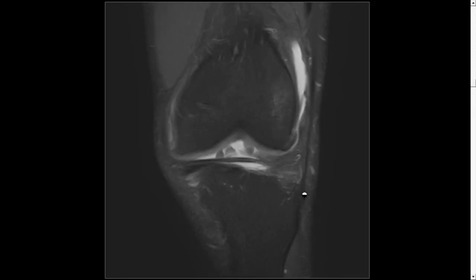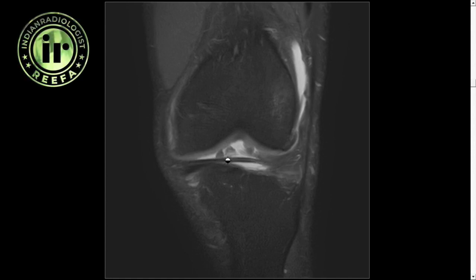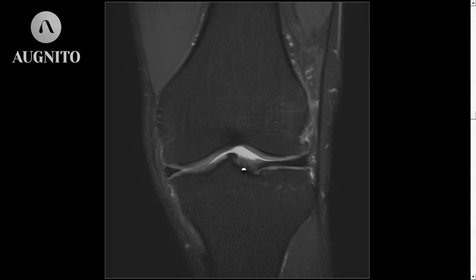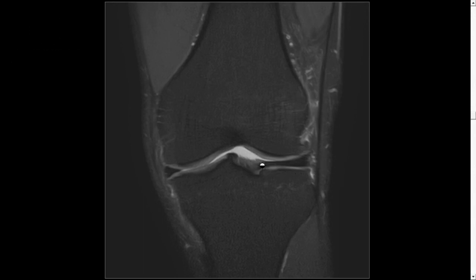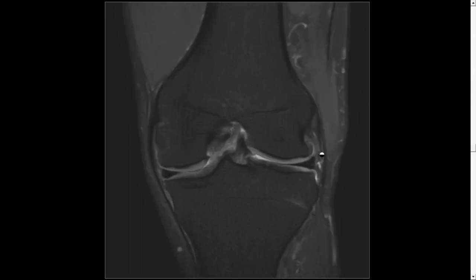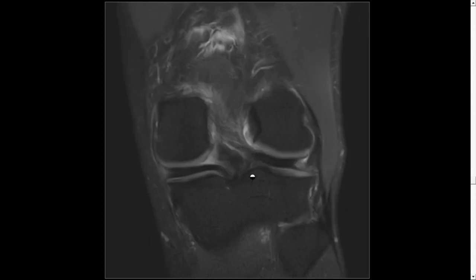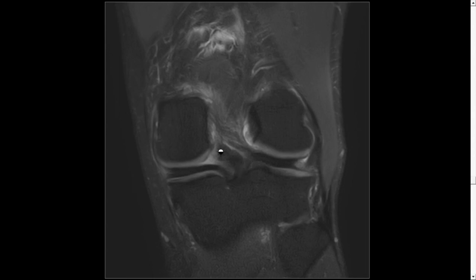Coming to the coronal plane from anterior to posterior: anteriorly we see the transverse meniscal ligament connecting the anterior horns of both menisci, the medial and lateral menisci, and the anterior root of the lateral meniscus. Progressing posteriorly through the bodies of both menisci, we reach the area of the posterior roots — the posterior root of the lateral meniscus, the posterior root of the medial meniscus, and the PCL. As discussed in anatomy, the posterior roots are very closely associated with the PCL attachment.